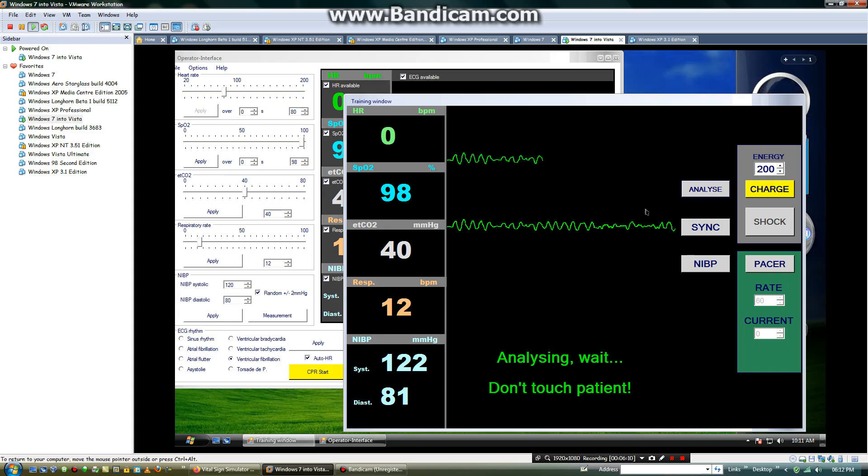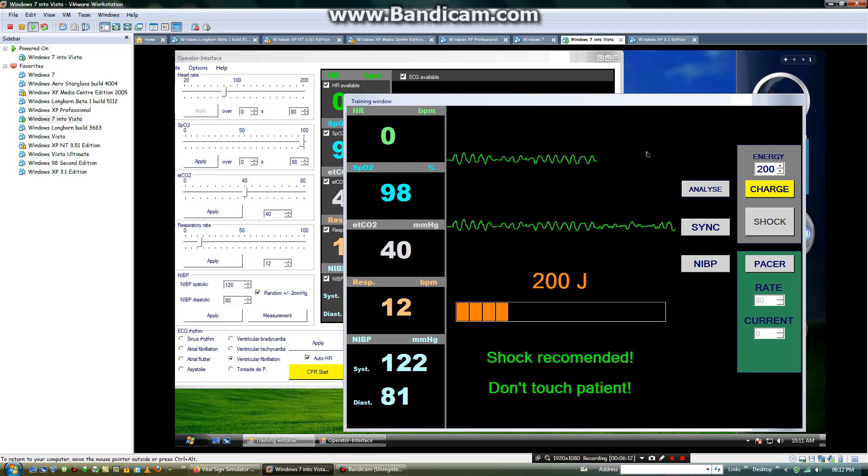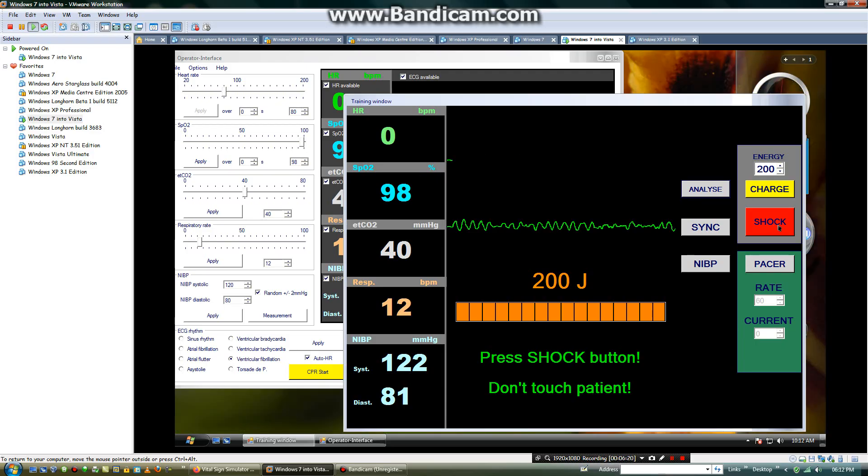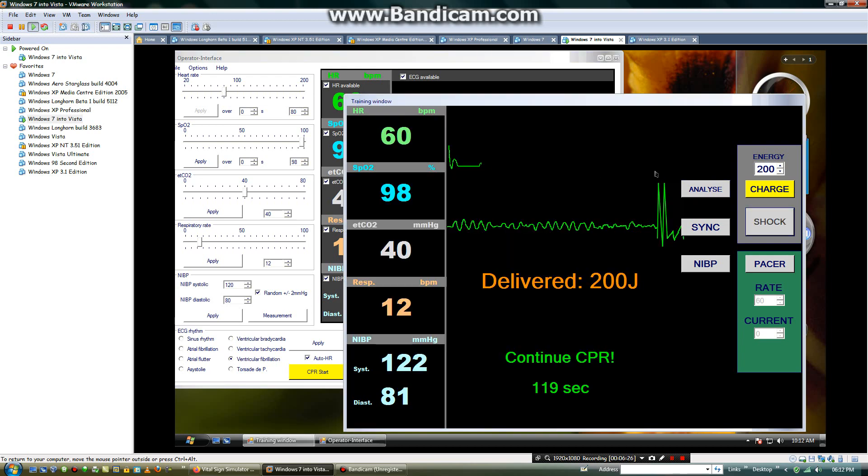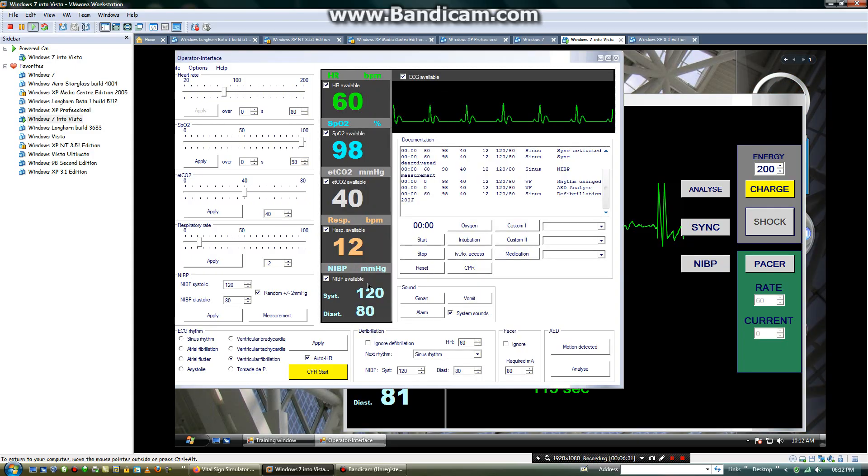Then you will charge the defibrillator. Stand clear. Push red button to shock. Then this is the correct button which you should press to shock the EKG defibrillator. Then it will move again back to sinus rhythm.